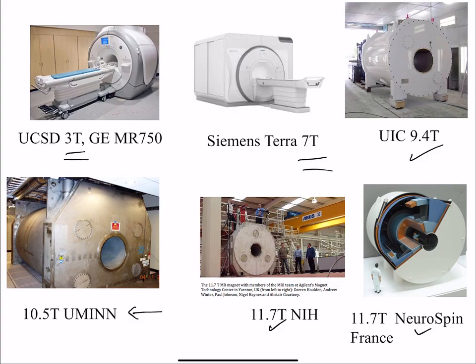Yes? What are the benefits of having a stronger magnetic field? Yeah, so the main thing, which we'll get into later, is sensitivity. So you're going to be able to see things that you can't see at the lower fields. Okay.